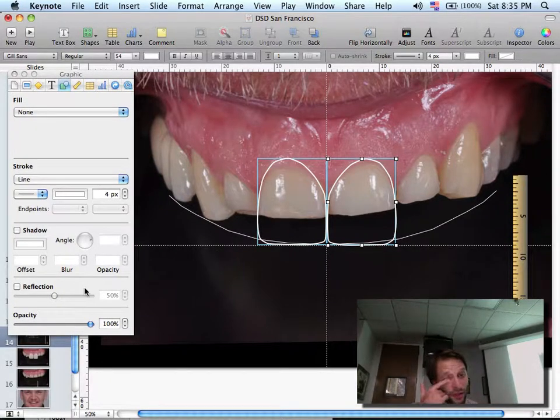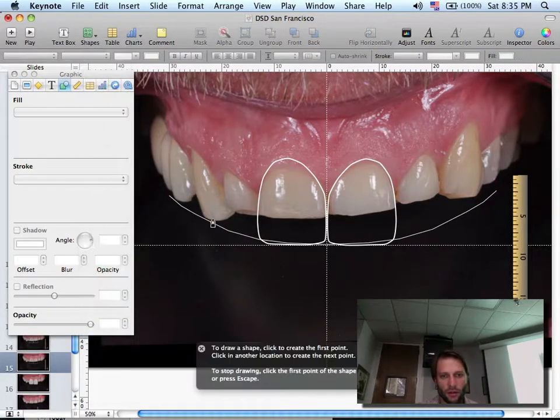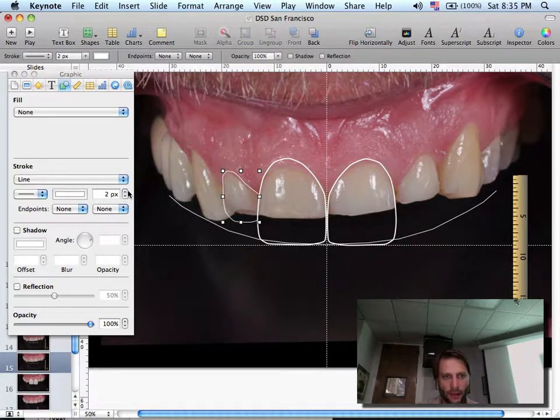So just continuing here so we can finish the last step. Since I have the outline of the teeth, I will just delete the rectangles because I don't need to play with proportion anymore. I just have the shape now, and I can just draw the laterals. Make it a little longer already. Smooth the path. Make it a little thicker. Make it a little longer. I don't want to touch the line because I want some dominance on the central.